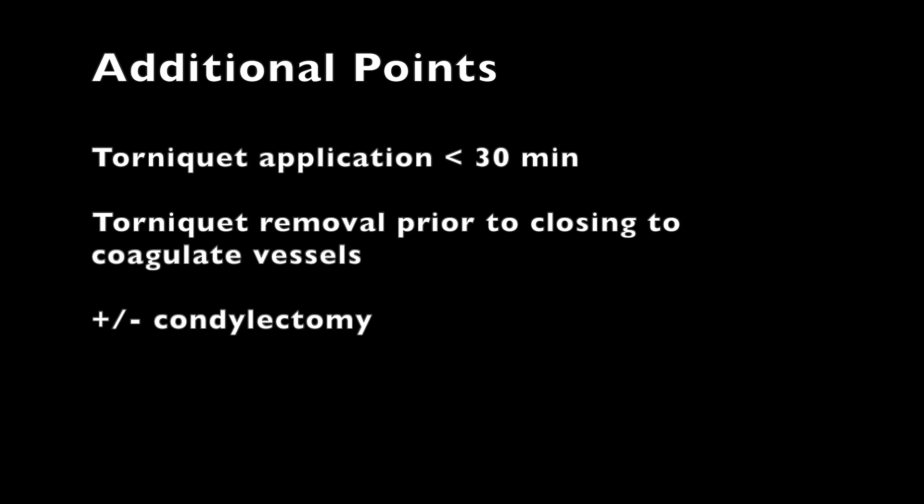Condylectomy, or removal of the remaining joint surface, is not necessary. Typically we would perform it if there are any issues with skin closure.